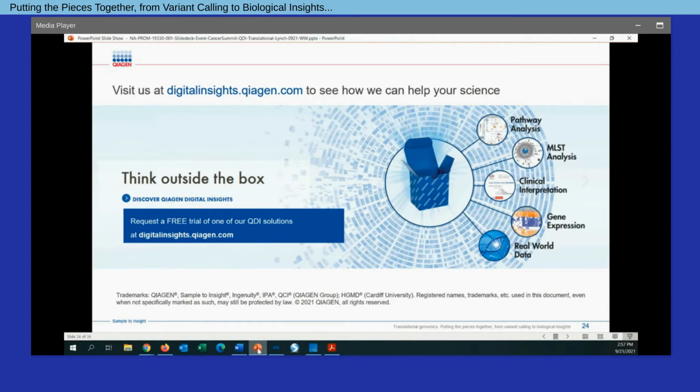Another question here. Does Qiagen Clinical Insights perform analysis on microbes for virulence or metabolic genes, for example? So currently, the curation efforts for the knowledge base are focusing on human data sets. So essentially, it would fall under the context of two main areas: hereditary disorders, looking at human germline data that we curate from the literature and through third-party databases, and also then somatic changes. So again, all of this is in the context of human data specifically for variants. So the short answer would be no.